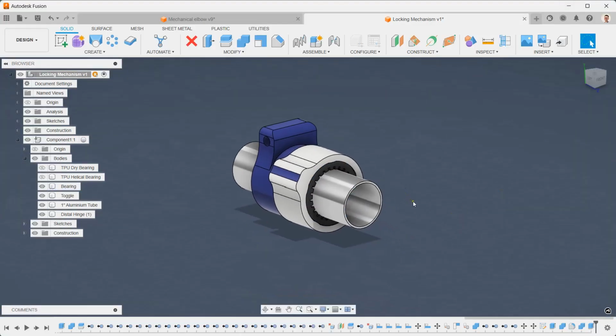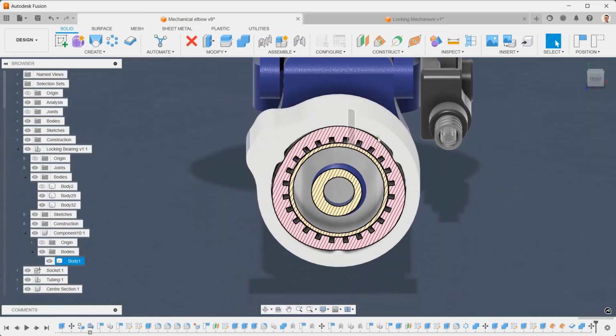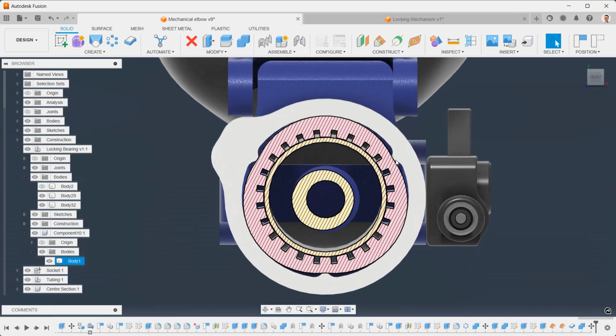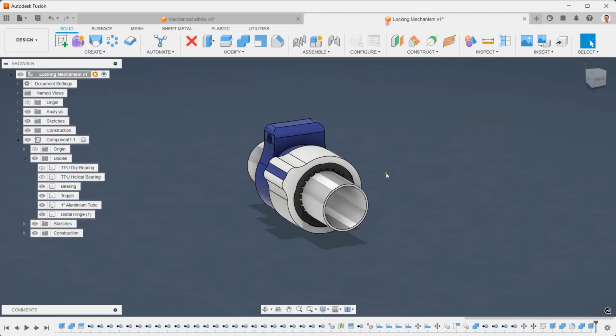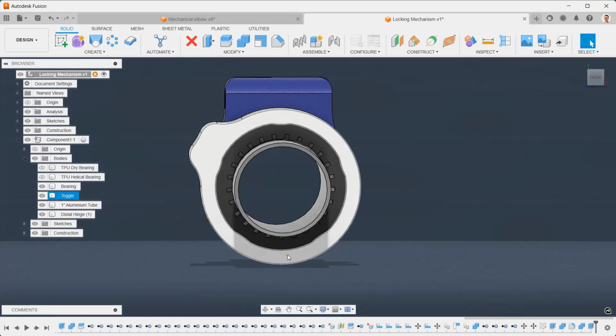In terms of the advice last night, it was pointed out that the three lobe design, thank you for that word, Tyler, might have a little bit of a steep incline here. So when these teeth rotate and bite into the TPU, it might be asking it to do too much too soon. So we're going to go for a more gentle angle. And following Tyler's advice, I've gone for five lobes now. 1, 2, 3, 4, 5, and 5 teeth to bite down on a much shallower pitch.